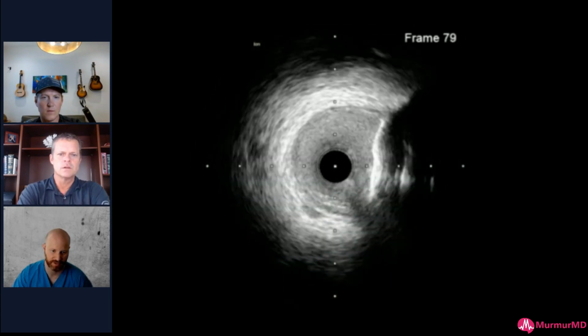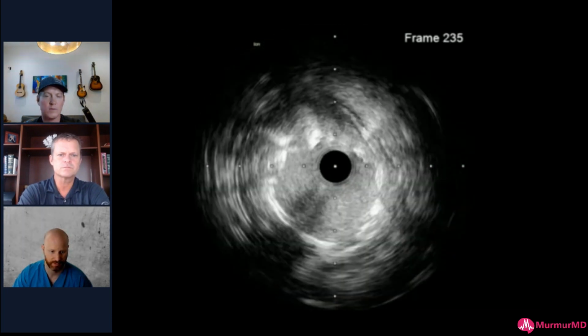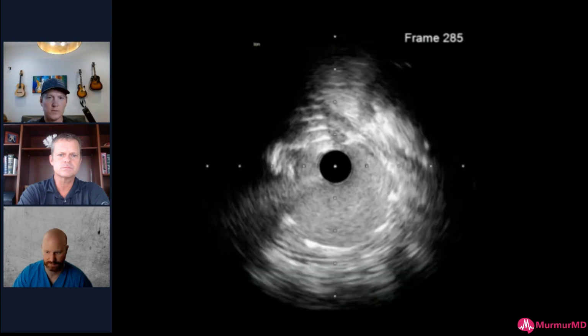It's sort of critical. And you can see how much bigger this is now, right? Yeah. I mean, this is a much bigger stent than what was there before, and we have good coverage to the ostium where that left main takes off. So we're happy with it.